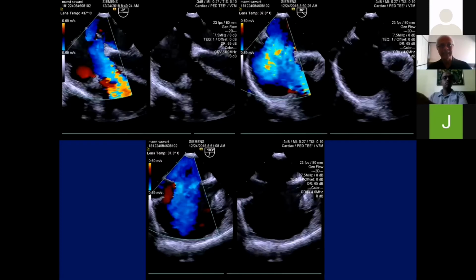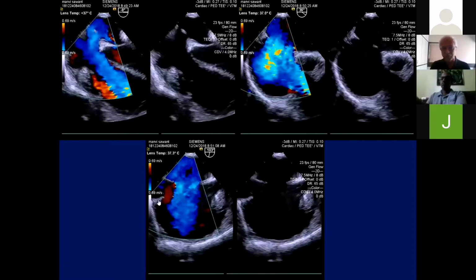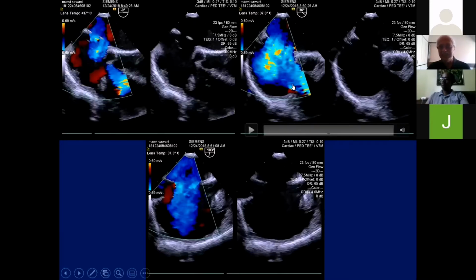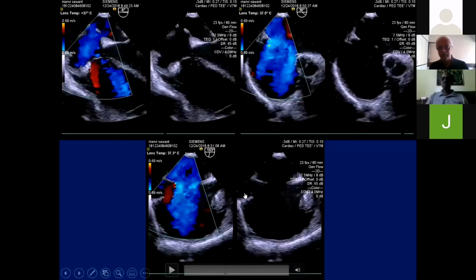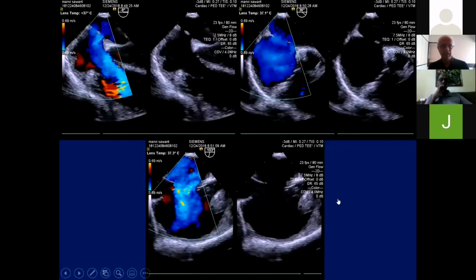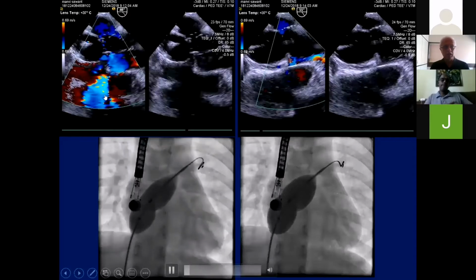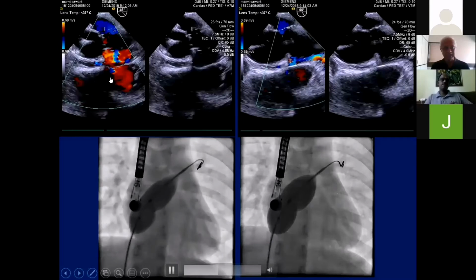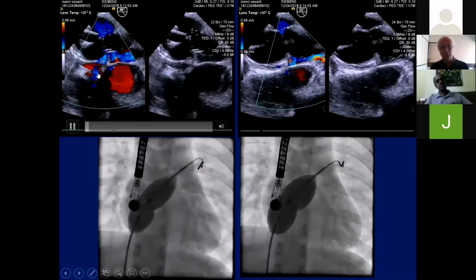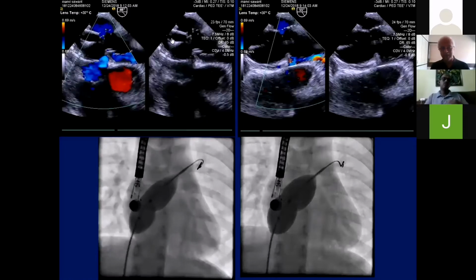Now, this is the case that you saw, where there was a large defect and a small strand of tissue crossing over. And this can be seen even in short axis. However, these two defects were not so well seen in bicaval. Now in this, what we did, we started first with balloon occlusion just by stop flow. And you can see that there is a definite shunt which is seen through the second orifice, which was on the anterior and superior aspect of the main defect.